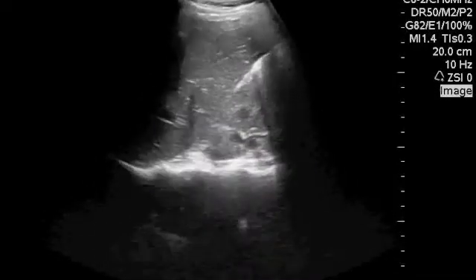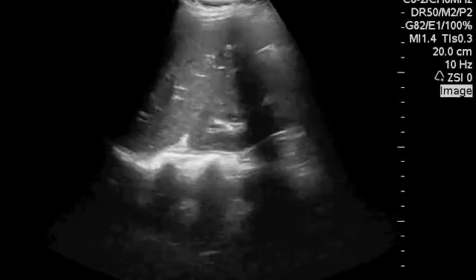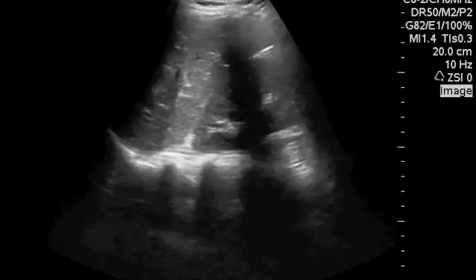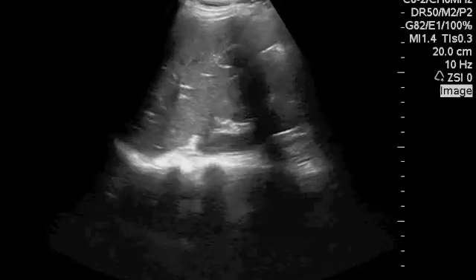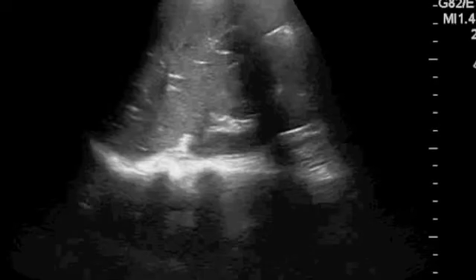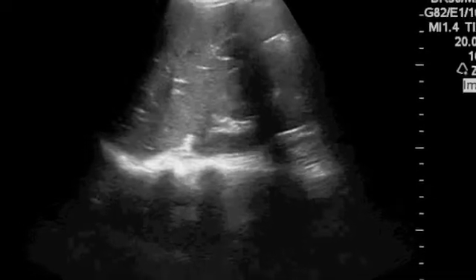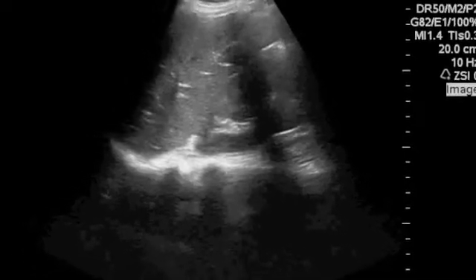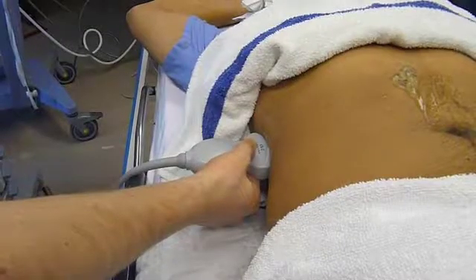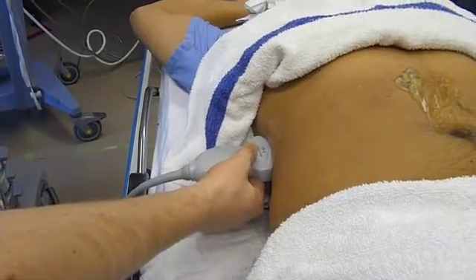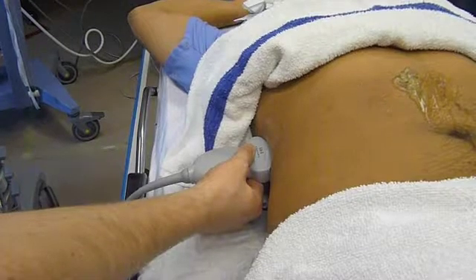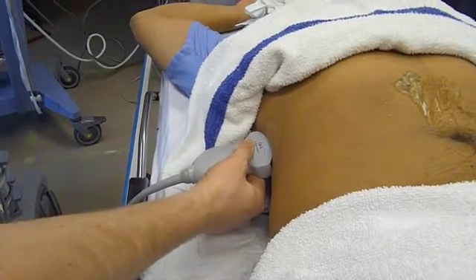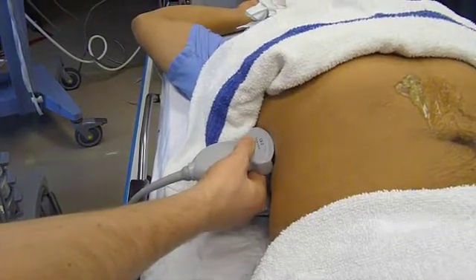Here's what that looks like on the screen. You see the kidney coming into view there. Once you get the best kidney you can find, stop at that level. As you make your AP move, don't let your probe get away from being parallel to the floor.